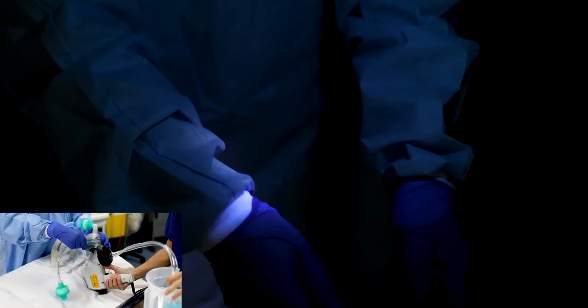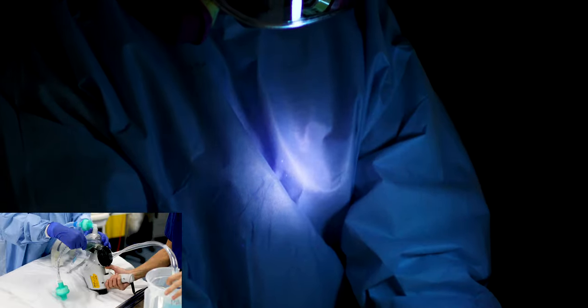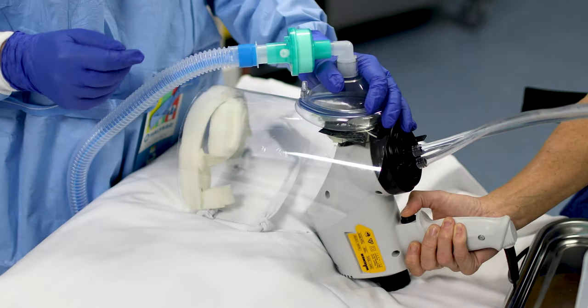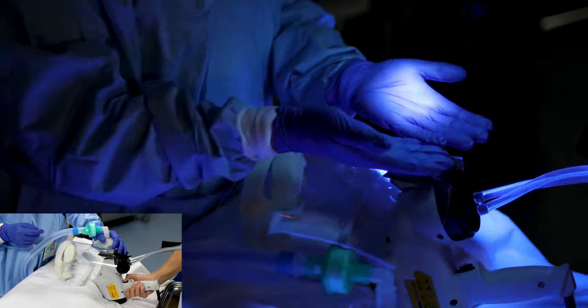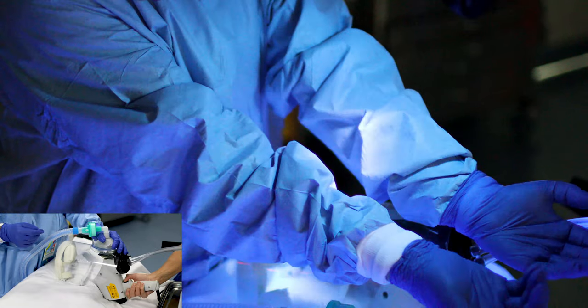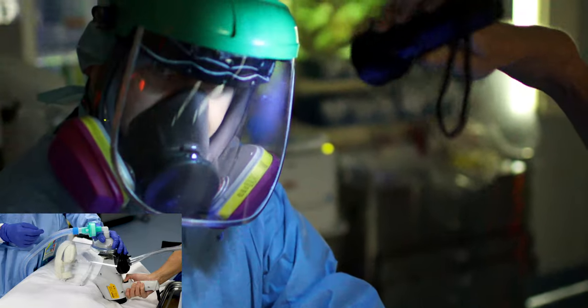This is a technique where the endotracheal tube is removed whilst the face is covered by an anesthetic mask. There was mild contamination of my hands and right forearm, a few drops on my torso, and nothing on my face. When I simulated a cough into the mask firmly applied to the face, the only contamination we could find was a small streak on my face shield. The leak on an actual patient obviously may be larger than on the polycarbonate dummy.